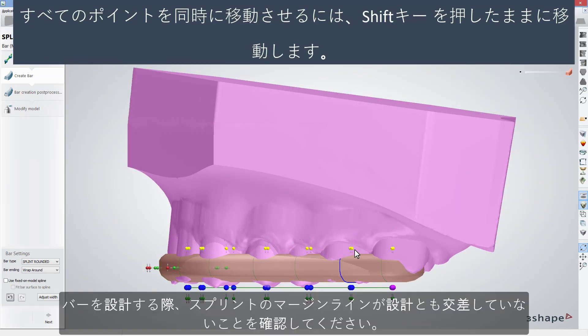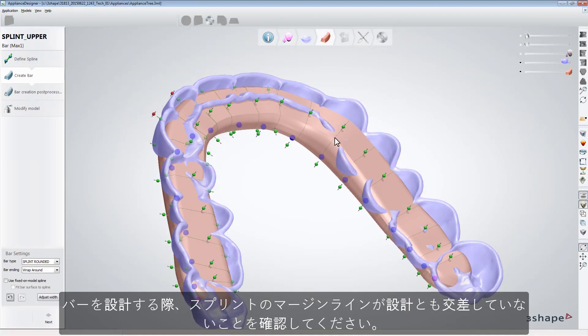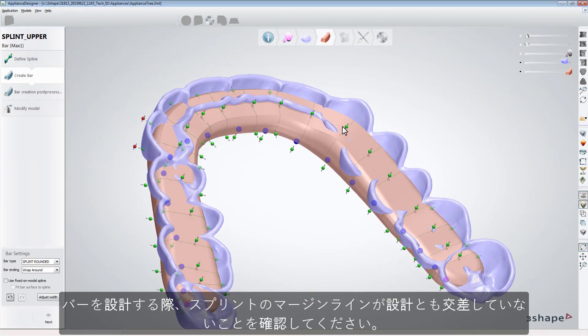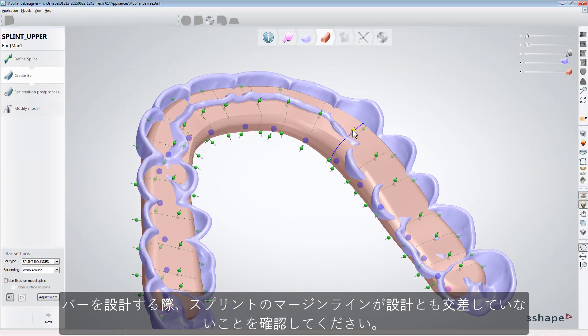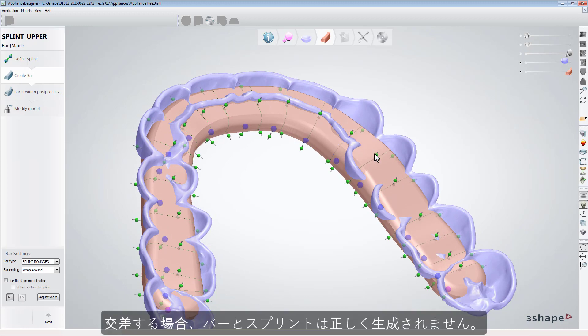When designing a bar, make sure that the design doesn't cross the splint margin line. If crossed, the bar and the splint will not be generated properly.